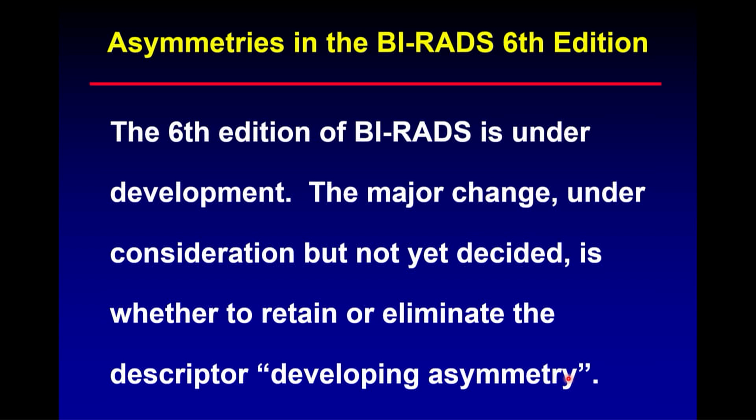One of the things I recommended to the BI-RADS committee, I don't know if they're going to do it, but they should, is if they drop the term, they have to add text to both the mass and the calcifications part, saying that if these findings are either new or increasing in size or more conspicuous, they are inherently suspicious. That would not be modality neutral, but subcategories of mammo neutral.